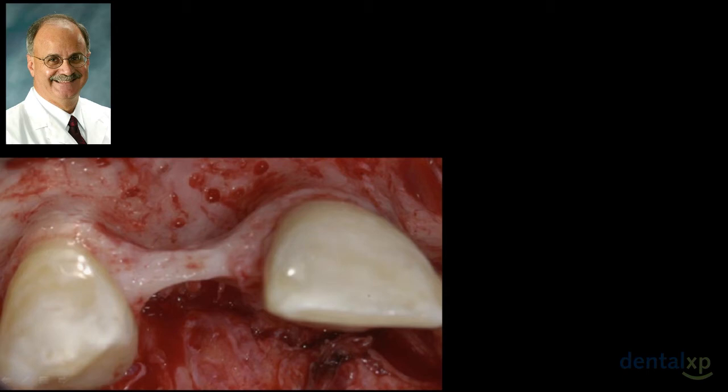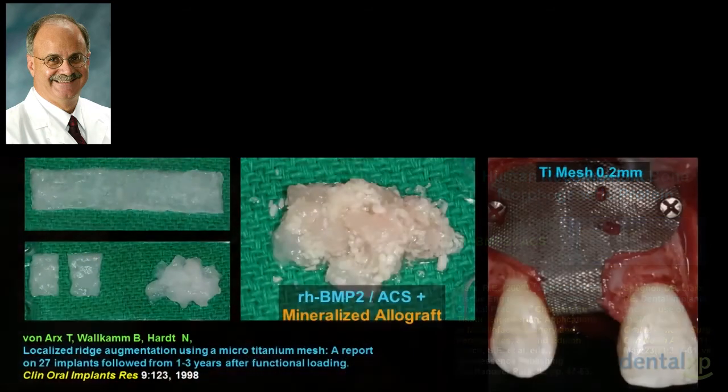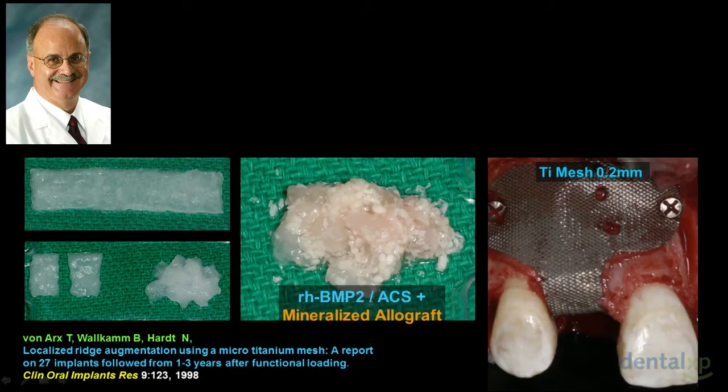Anybody want to block graft this case? You could. Facially, palatally, I've done that numerous times. Transcortical fixation, sure, can do that. Very technique sensitive, for sure. Or we have other options, of course, a GBR approach. And in Victoria's case, I chose to use the BMP morphogen, mitogen morphogen, which is fabulous. Needs a filler, needs some space maintenance. Remember the collagen sponge we talked about is just too soft. It flattens out. It doesn't maintain any space. So we use a filler. I like a mineralized allograft.